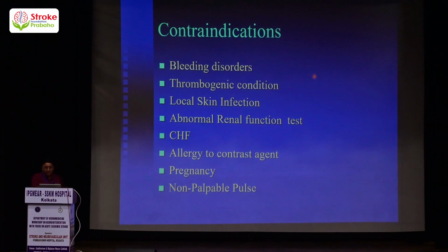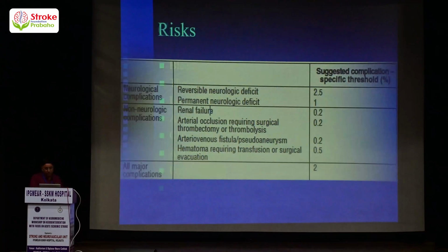There are some contraindications of the DSA: bleeding disorder, thrombogenic conditions, some local skin infection, abnormal renal function, allergy to contrast, pregnancy, and if there are no palpable pulses.